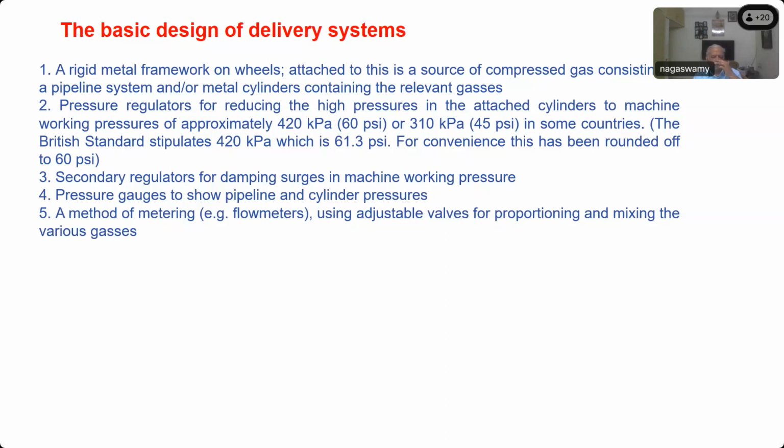But later it proved to be hazardous because inhaling carbon dioxide is going to cause what change in the body? Respiratory acidosis, sir. Fantastic. So that is the reason why that has been removed. Cyclopropane was there only for a very short duration, and it was not popular. Again, going back to the history, why was it not popular? Why did cyclopropane go out of use very fast? What was the characteristic of that gas, cyclopropane, which made it unpopular?